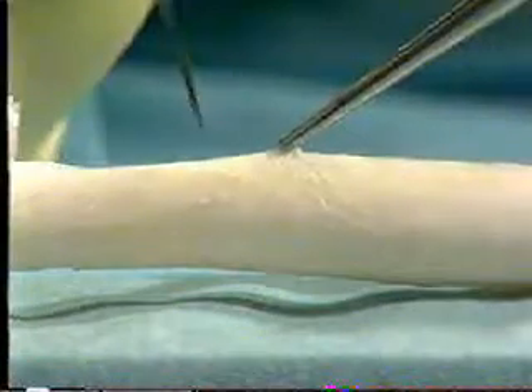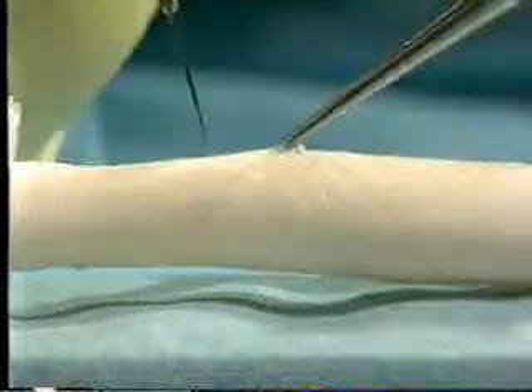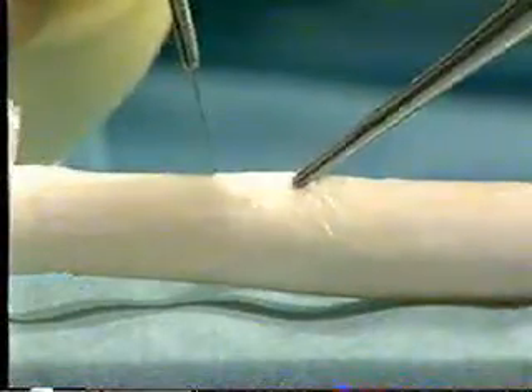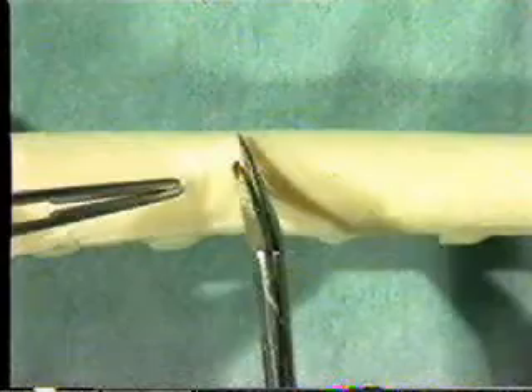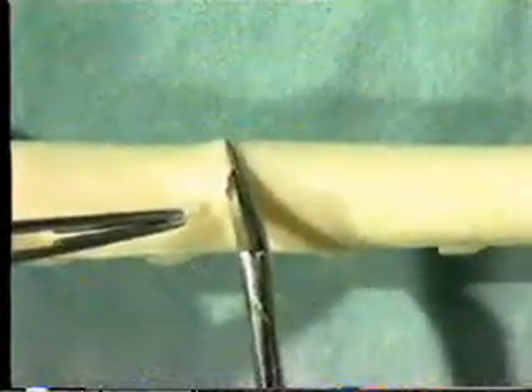Take a fine pointed blade and make a short stabbing incision in the anterior wall of the simulated artery, taking care not to go too deep and penetrate the opposite wall. Then complete the arteriotomy using angled pot scissors.